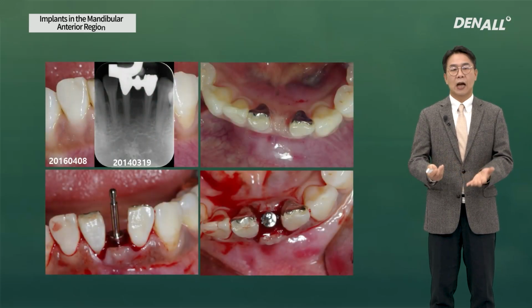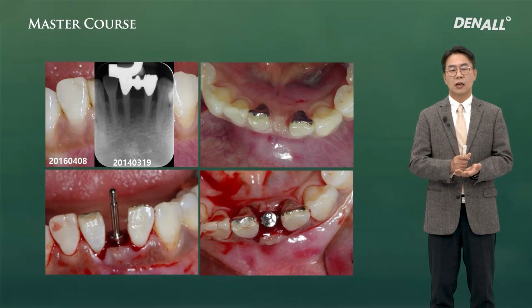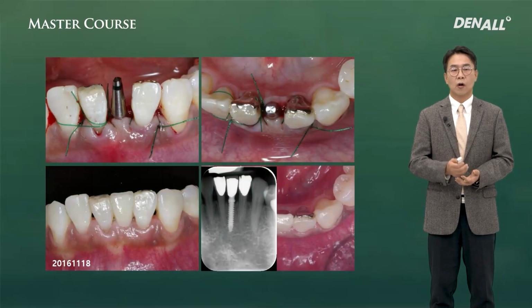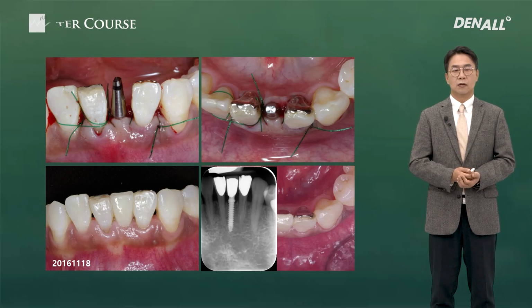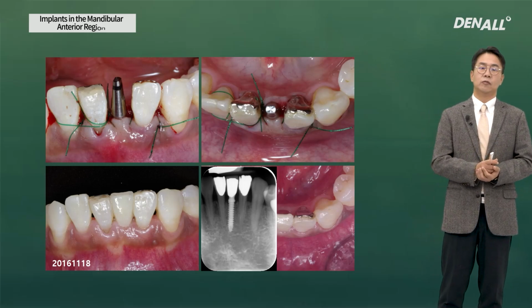This patient has a Maryland bridge in the mandibular anterior. A proper diameter implant is chosen. Deficient bone is addressed with bone graft in a standard way. According to the result, prosthesis is completed. If you look at the contour of gingiva, it looks very natural, and it is even above the contour of gingiva in the adjacent natural teeth.